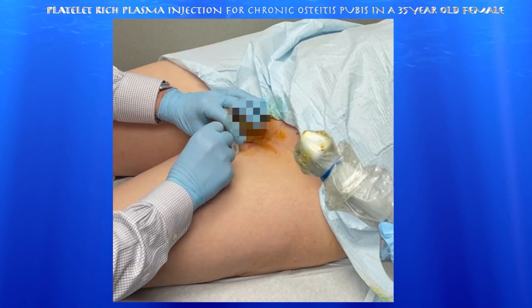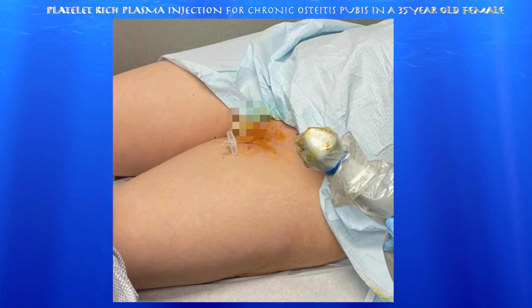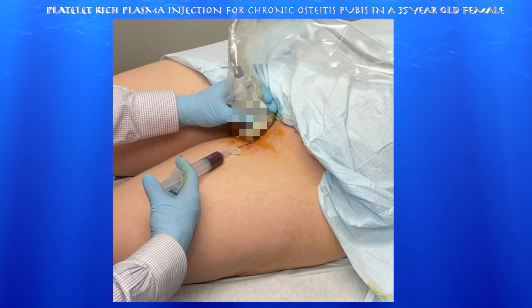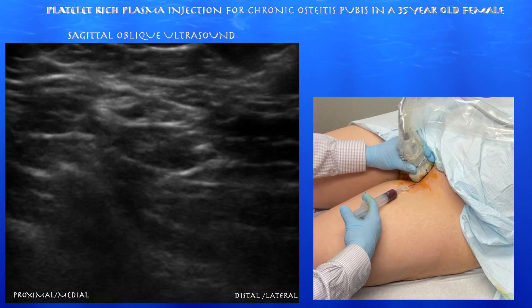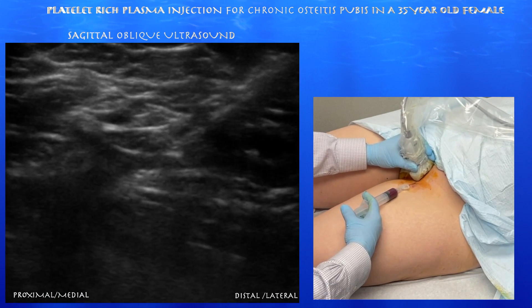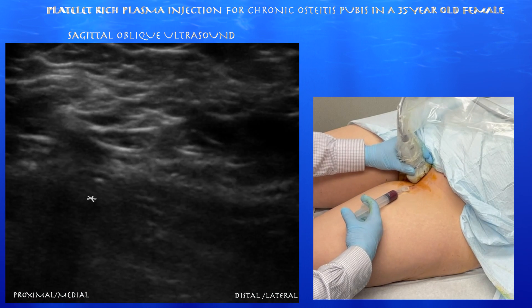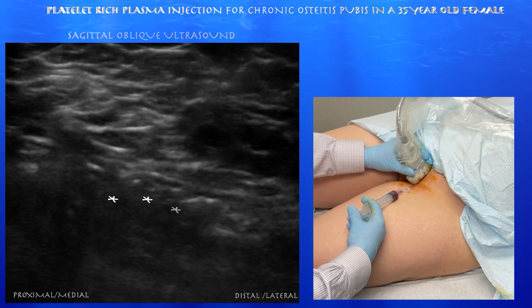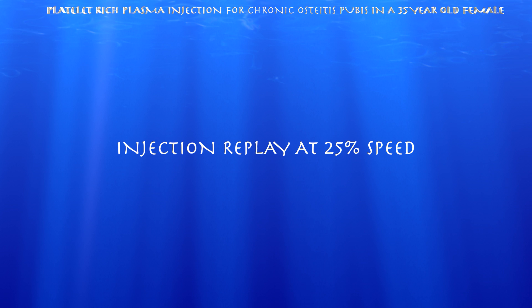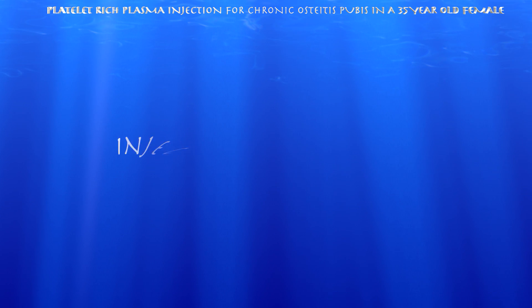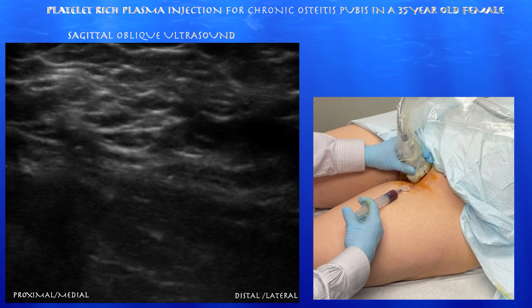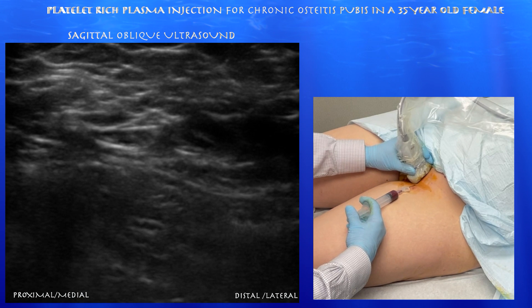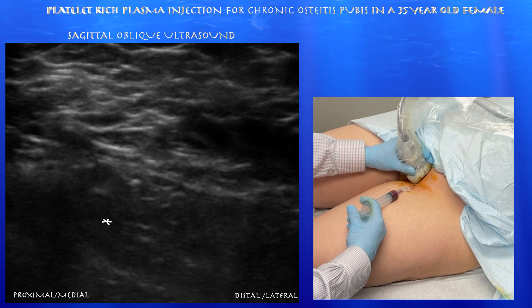We have the needle where we wanted, just near the origin of the adductor musculature, and now we're going to start with the PRP injection. You can see the needle tip essentially right at the adductor longus tendon, and here's the PRP spreading superficial to the adductor longus tendon. Here it is in slow motion — we can see that flash of the PRP going over essentially the adductor longus muscle and tendon.